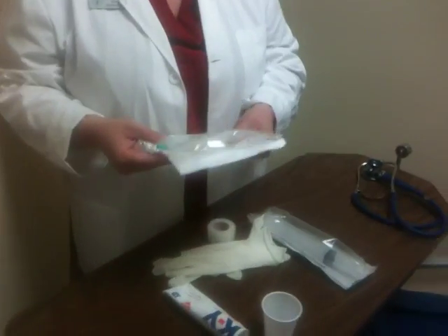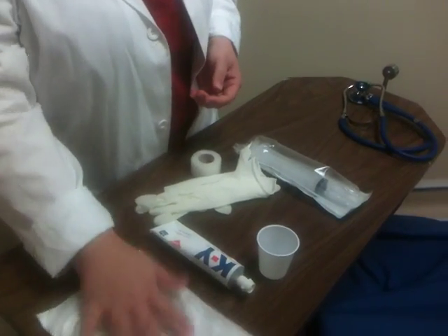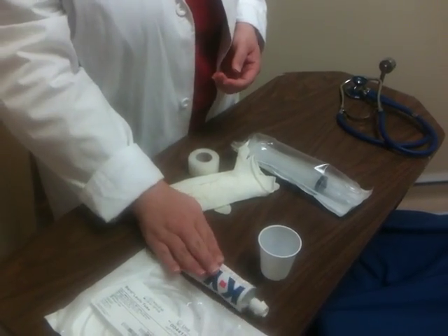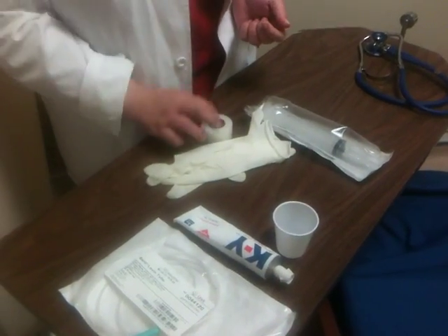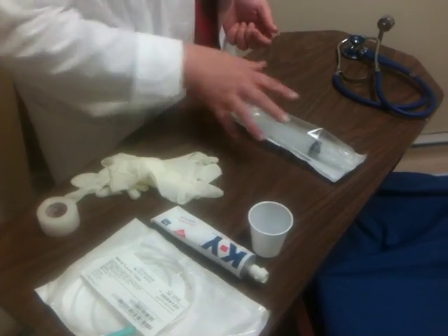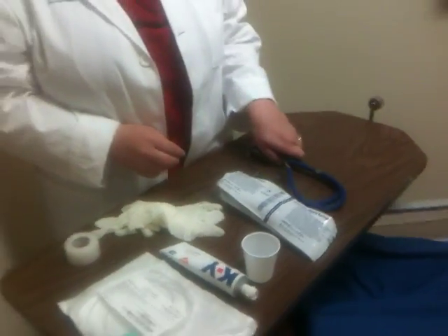Once you have verified that, then you would go to your supply room and get the supplies that you need. You're going to need your NG tube, which you're going to pick based on what you're doing it for. We talked about that in lecture. You need some water-soluble lubricant. I've got a cup of ice or water for our client to swallow, tape, gloves, a 60 cc catheter tip syringe, our stethoscope, and also if your room does not have suction equipment, we would need to make sure we take that in with us as well. So we have our equipment ready.